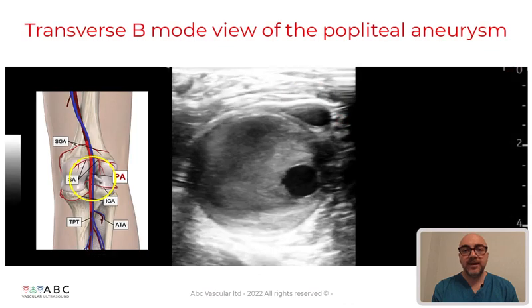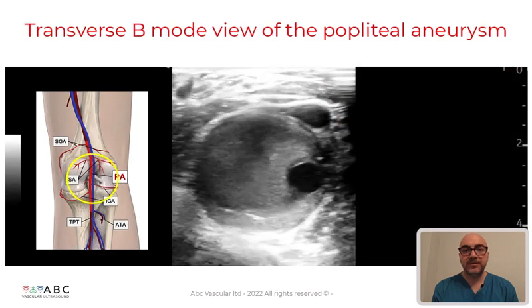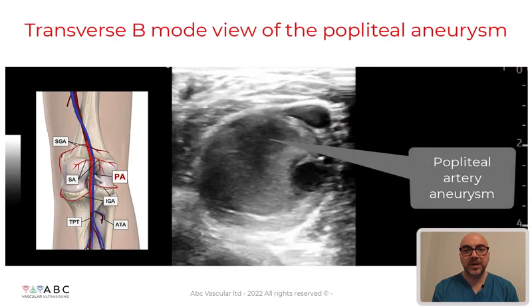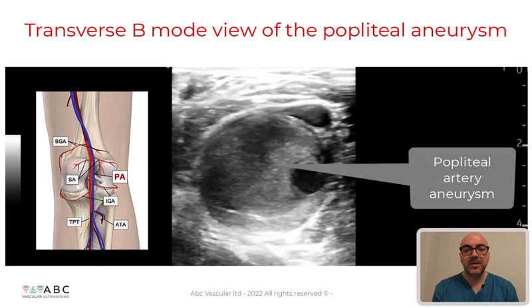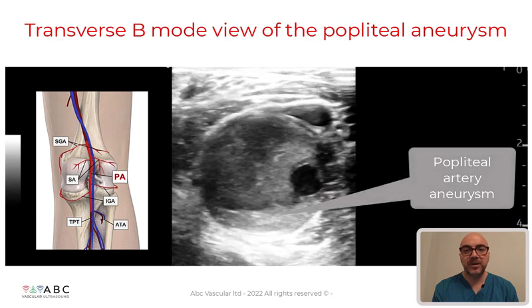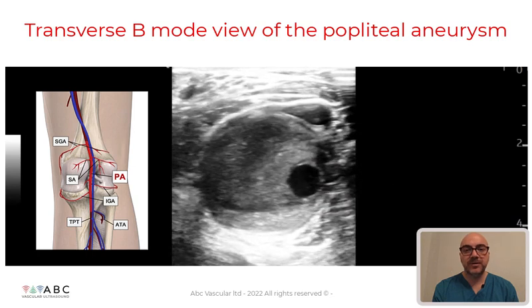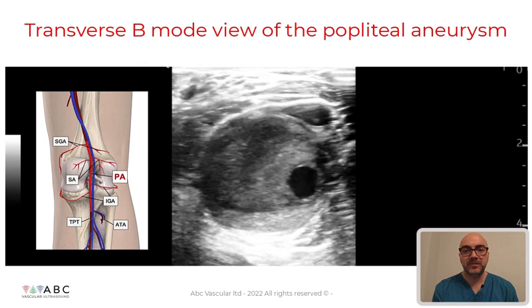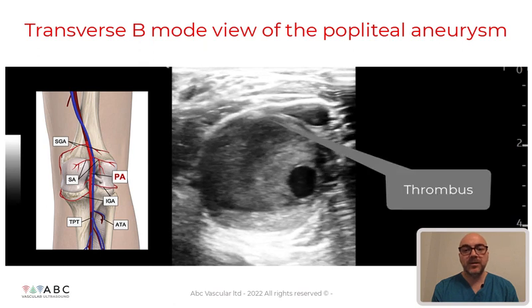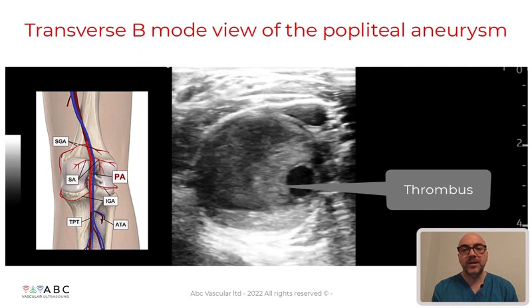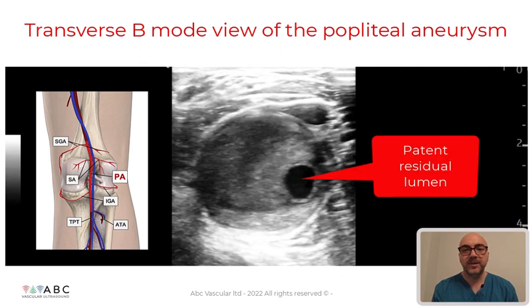Starting at the level of the popliteal fossa with the transducer in transverse view and B-mode, we can appreciate a large aneurysm of the popliteal artery which involves all segments of the artery. We can also note the presence of significant mural thrombus and we can identify a small patent residual lumen.